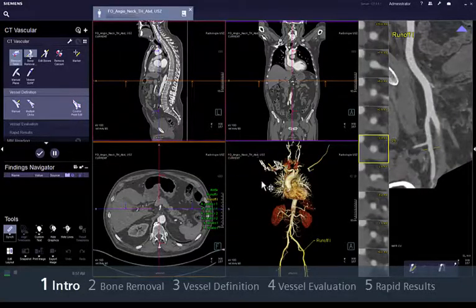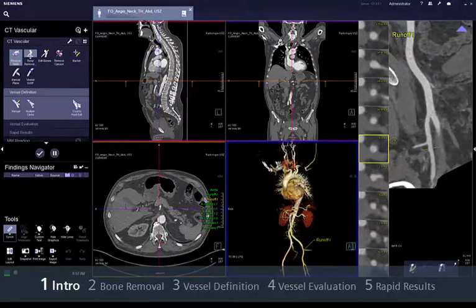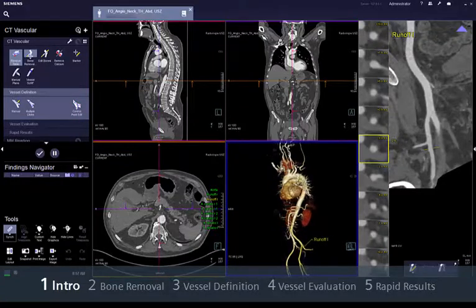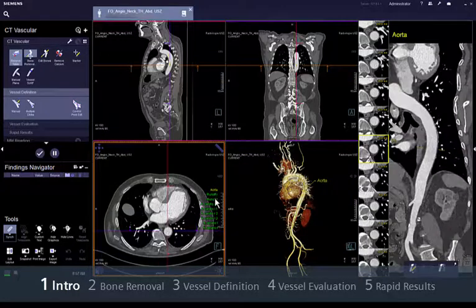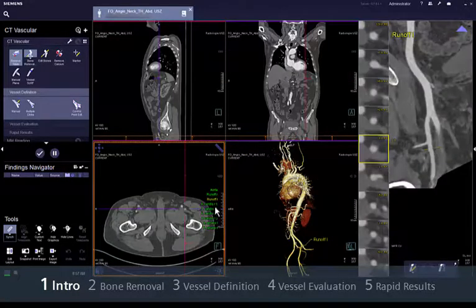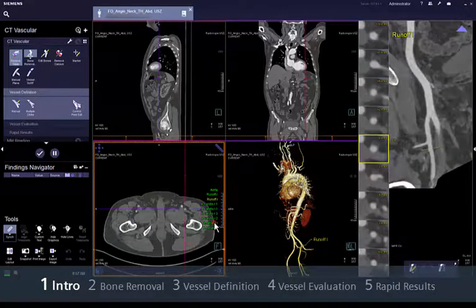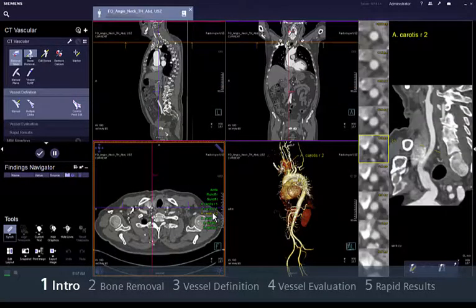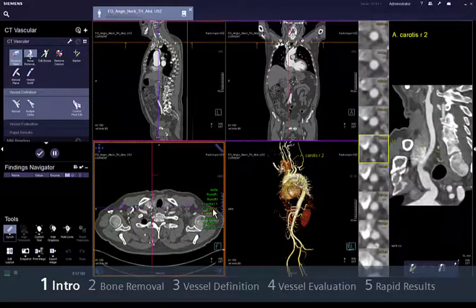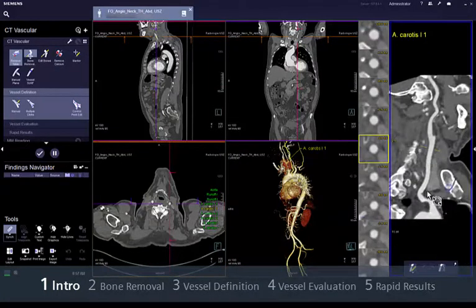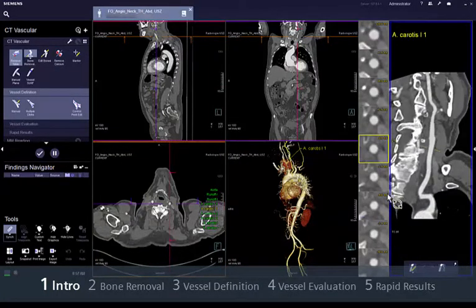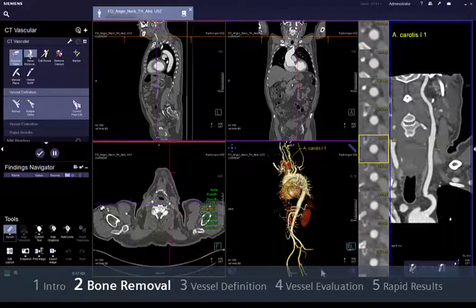As soon as you open this task, Syngovia has automatically pre-processed the images by removing the table and bones and segmenting and labelling the applicable vessels such as the aorta, the left and right runoffs, the renal arteries and the internal and external carotids. They will be displayed as curved planar re-formations in a dedicated layout.